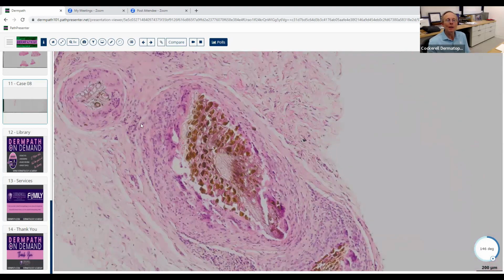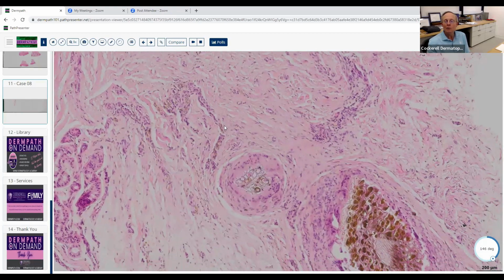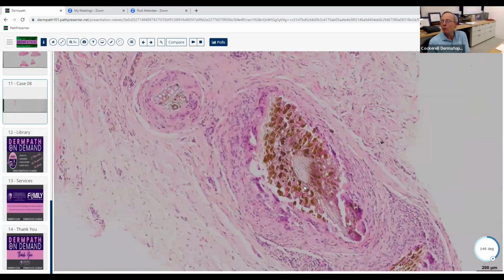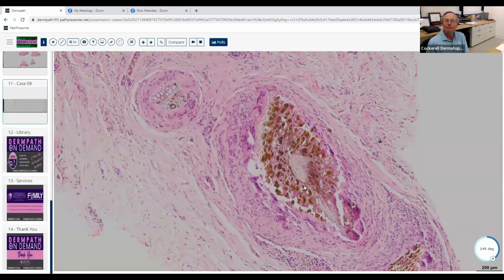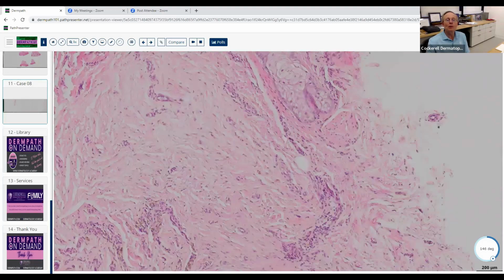Would you tell the patient that they need to go get placed on amphotericin because they've got a dermatiaceous fungal infection and they may die from it? Or what would you say in that setting? So I guess if it was fungal hyphae, I might. So if we're thinking tinea nigra, then tinea nigra is going to live way up here in the epidermis.